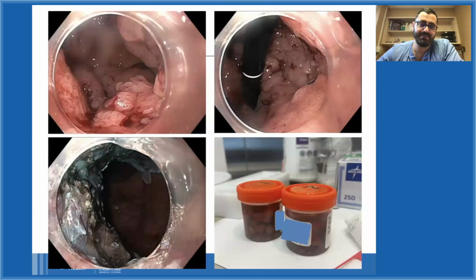So this is another patient who was referred to me, a very nice woman referred to me with a large rectal polyp. This by far is the biggest polyp I have ever seen over the last 7 years since I started doing GI. So you can see here, the polyp is all this, all this, all this, all this. In fact, I could not fit the polyp in one picture. And this is in retroflexion. I could not fit the polyp in one picture. This is how big it was. It actually took me approximately 6 hours working on this polyp. And this is how it came out.